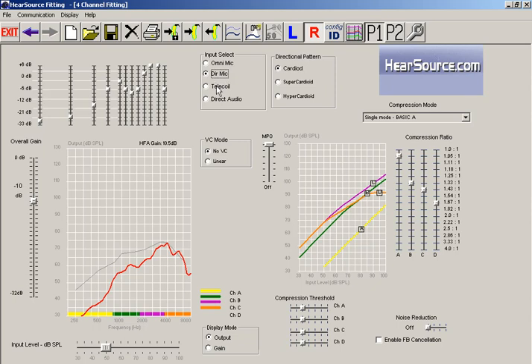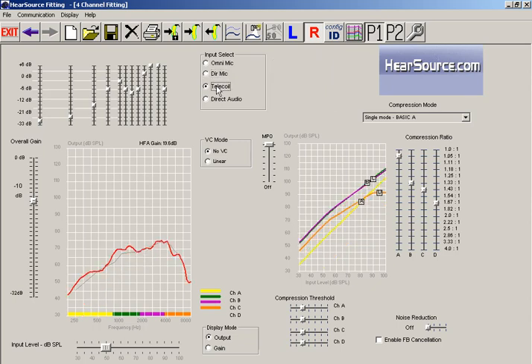The next input selection is the telecoil mode. Now what a telecoil is, think of it as like a little antenna that sits inside the hearing aid. And when it's activated, you're actually shutting off your microphone and you're activating this telecoil.